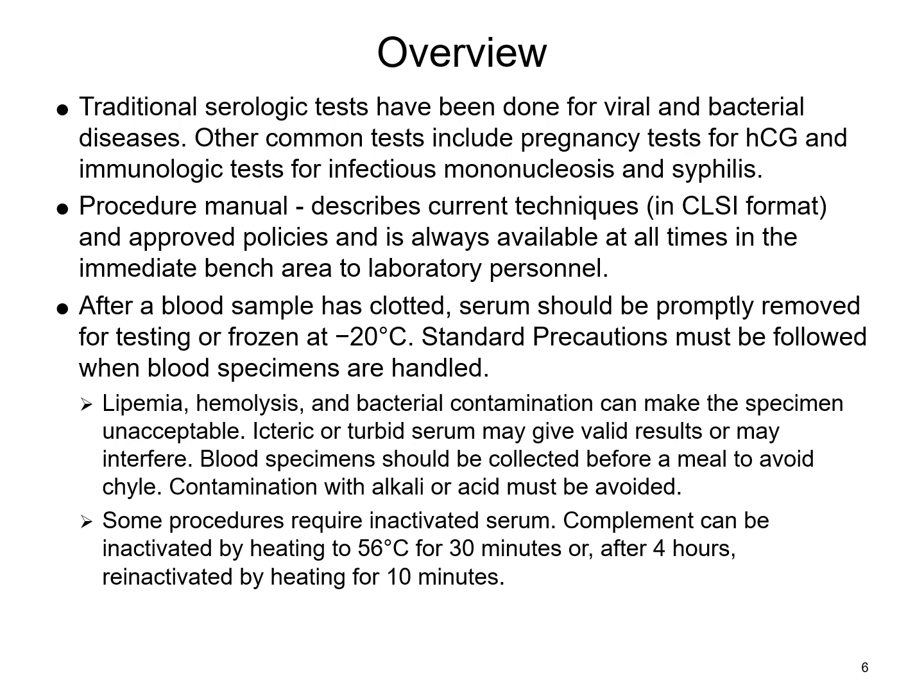If the specimen is collected in a plain tube, it should be allowed to clot so that serum can be properly and promptly removed after the clot has formed. This helps prevent any further degradation. Depending on the test procedure, it could require additional prep of that specimen. For example, it could require a frozen specimen, especially if the samples can't be tested right away or within a certain time frame. So make sure you are familiar with that for the particular test you're doing. Even if it is a send-out test, you may still have to do some of these preps.